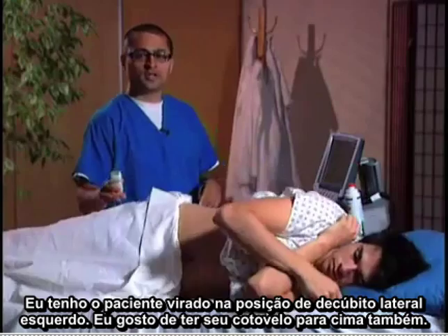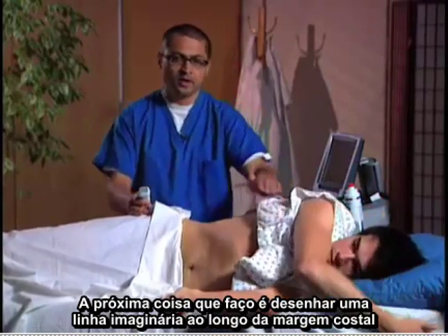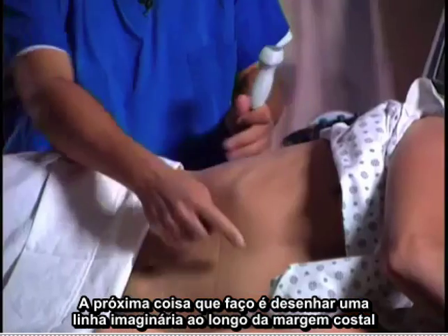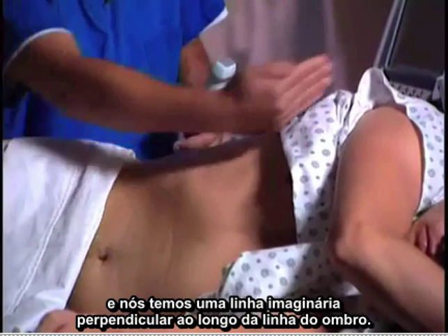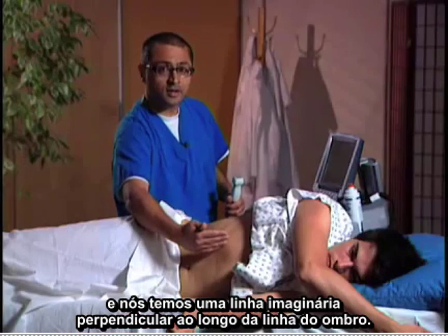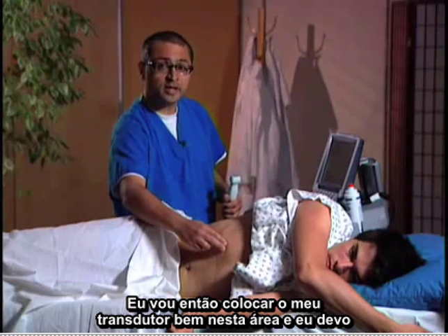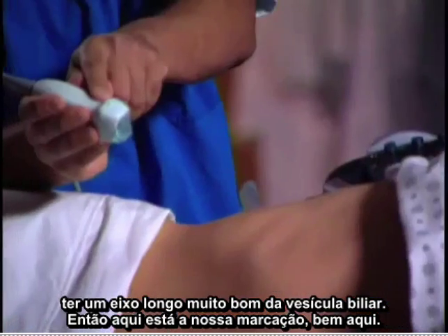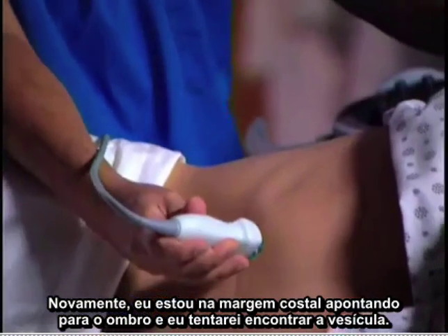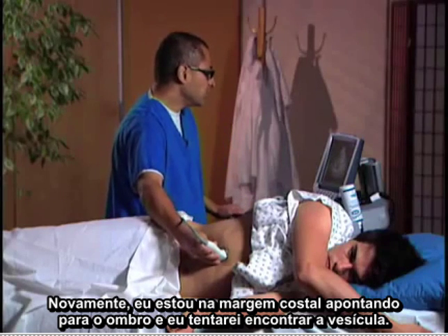I have the patient turn to the left lateral decubitus position, and I like to have their elbow up as well. The next thing I do is draw an imaginary line along the costal margin, and an imaginary perpendicular line along the line of the shoulder. Then I'm going to put my transducer right about in this area, and I should have a very nice long axis of the gallbladder. Here's our transducer marker right here. Again, I'm at the costal margin pointing toward the shoulder, and I'll try to find the gallbladder.